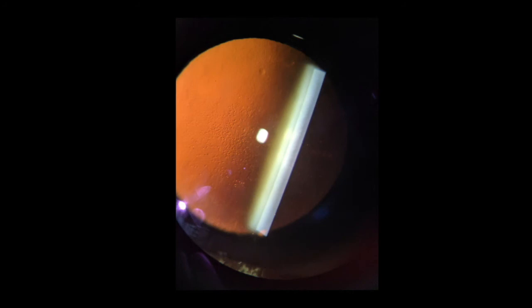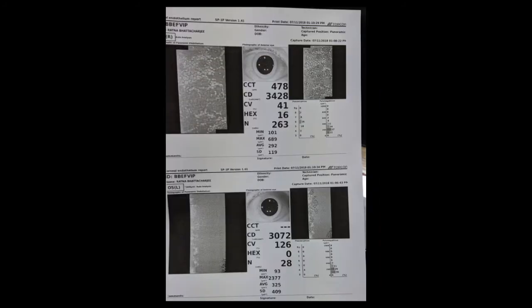Now the most common scenario is when a patient with cataract and guttate comes to you, you order a specular microscopy and a report comes to you which shows that one of the eyes has a CCT of 478 with a cell count of 3428. In the other eye, the CCT could not be measured but had a cell density of 3072. If you look at CV and hexagonality in both the eyes, they are significantly abnormal, indicating poor quality of cells. Now, if you were to rely only on the cell density as a parameter to decide, it can lead to a big surprise in the post-op period.